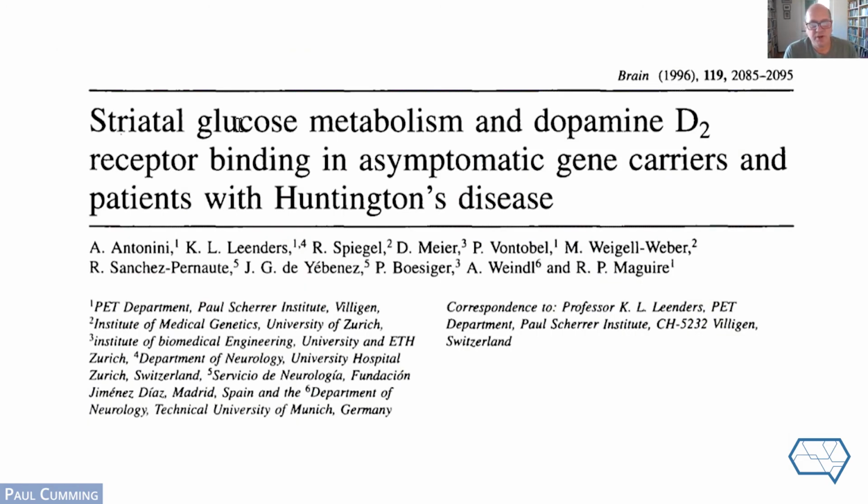So I've talked only about FDG, but I've pointed out that one of the very early findings in metabolic PET, in addition to the hypofrontality, is the loss of metabolism in the basal ganglia, which is a vulnerable region in the brain. The basal ganglia, normally referring to the caudate and putamen, is the dopamine-rich part of the brain that substantially degenerates in Huntington's disease, as could be seen in that gross anatomic specimen where there was practically none remaining. And that surely is responsible for the main part of the motor symptoms of Huntington's.